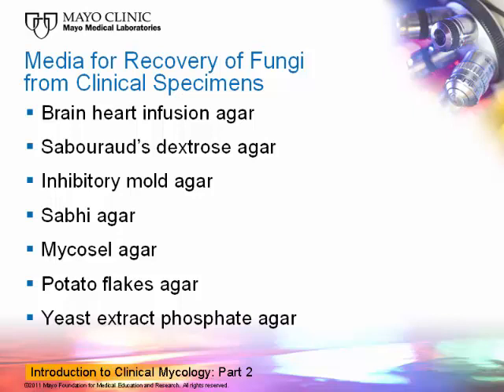In terms of trying to make a definitive diagnosis of an organism, first you have to be able to culture it and grow it up before you can make an identification. Then you're faced with which media to use for trying to grow these organisms. There are a number of media available that have been around for many years, and a few new ones. Brain-heart infusion agar has been around for a long time and works fine for recovery of fungi. Sabouraud dextrose agar has been written about in textbooks for many, many years, and is probably the worst medium for growing fungi that we have. It is a good subculture medium, but it's a poor primary recovery medium.